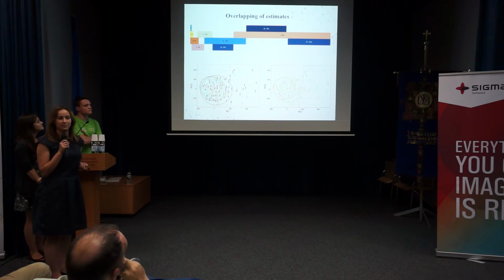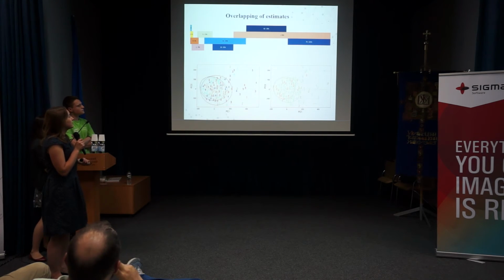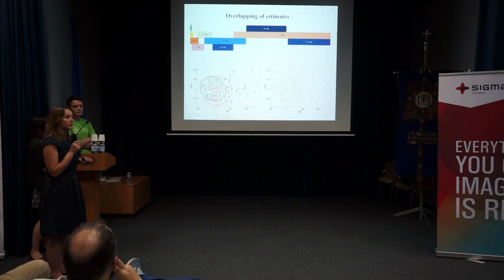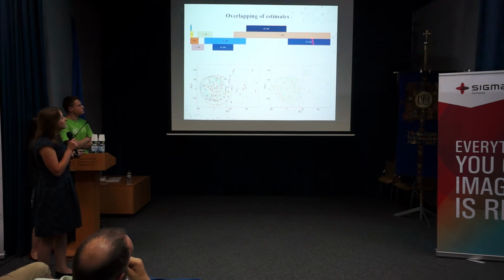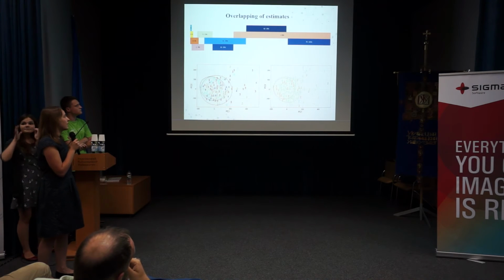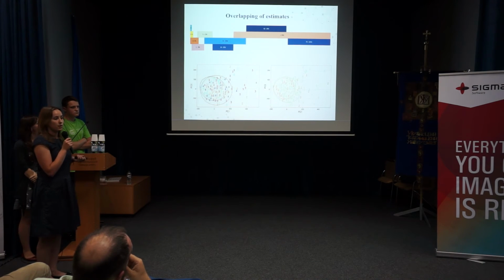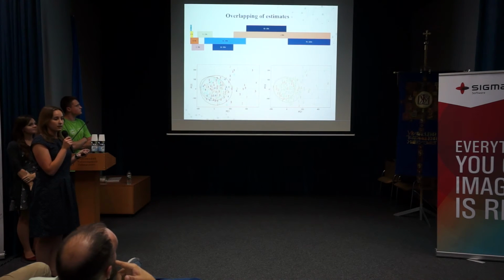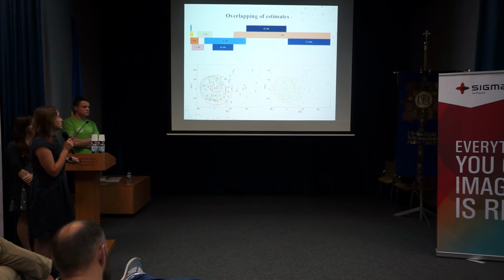So at this point of time, we transferred from the team of data preprocessors to the team of data analysts. And the first problem we faced was the very imprecise estimates of the doctors for the number of cancerous cells in the breast tissues. Here you can see the huge overlapping of all classes. Here's the very big class from 30% to 100%. It overlaps with this class and this class. So our solution was to split all these estimates into 5 classes first, which don't overlap with each other, and then into 2 classes which also don't overlap with each other.